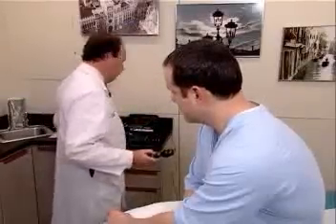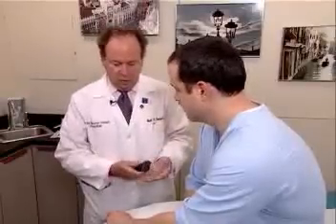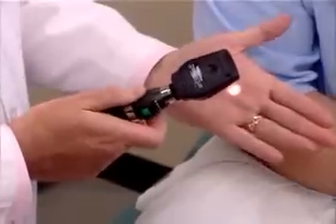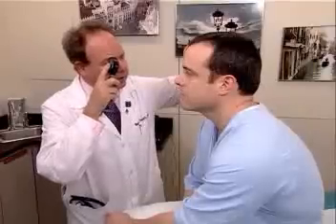In order to do this, you should remove your glasses and have the patient remove his or her glasses as well. If the person is wearing contact lenses or if you're wearing contact lenses, they may certainly be left on. The light should be placed on, as I'm demonstrating here, and the patient is asked to look in the distance. You should stand approximately 15 to 20 degrees off midline and elevate the patient's upper lid as the ophthalmoscope is placed against your right eye to examine the patient's right eye.